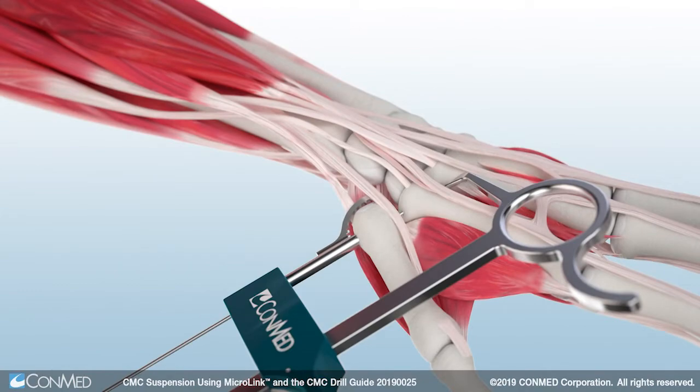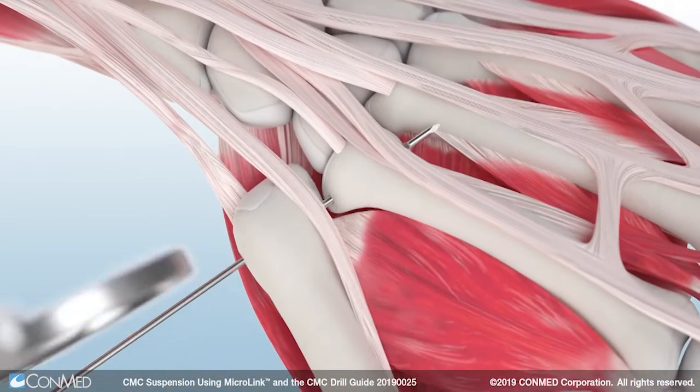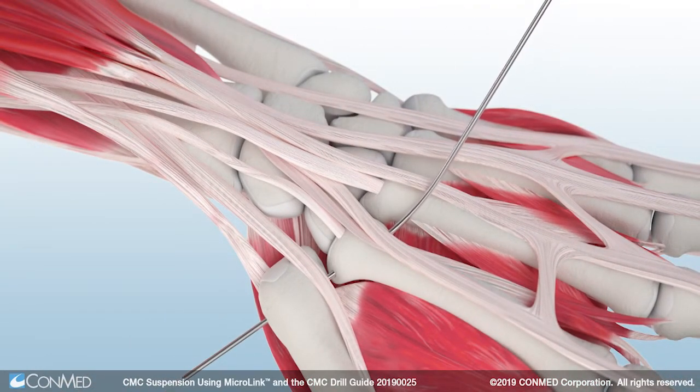Next, use a wire driver to insert the sharp end of the drill into the CMC drill guide and drill through all four cortices of the thumb and index finger.